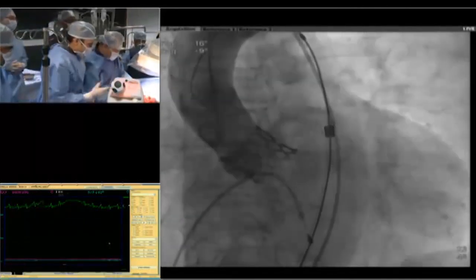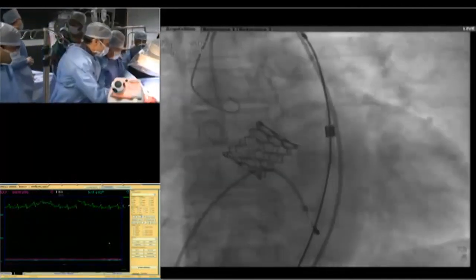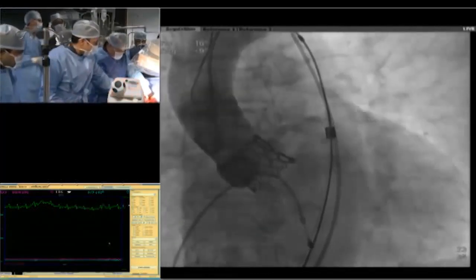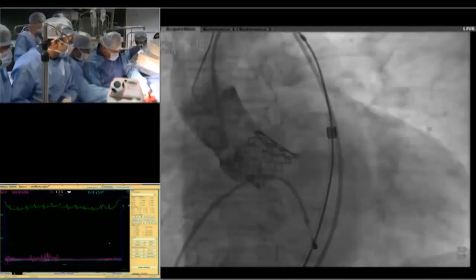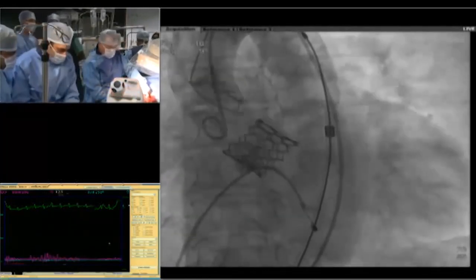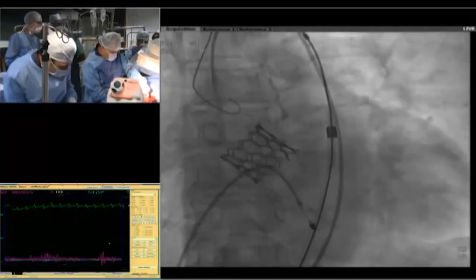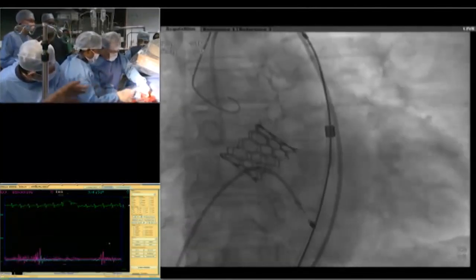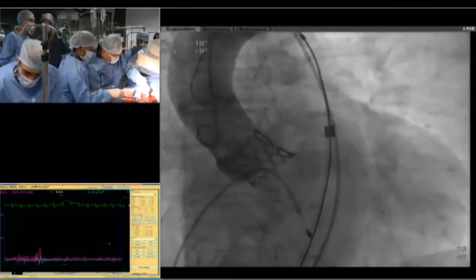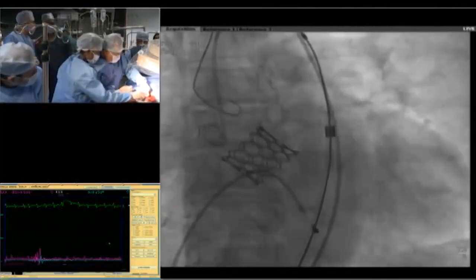Just pull up the ProGlide. Yeah. So we'll just pull up the ProGlide a bit more. We'll remove this, remove the whole thing. Yeah, I think leave the wire inside. Leave the wire inside. Yeah, it's a deflex. So what we're going to do is leave the wire inside. It's okay. Don't worry. Just remove that. Yeah, that's it.